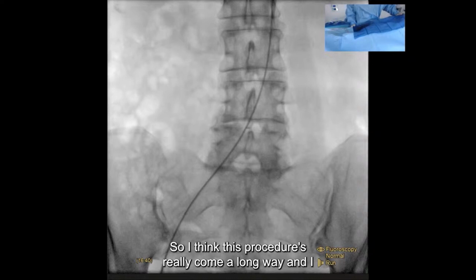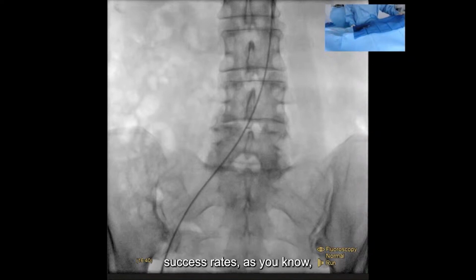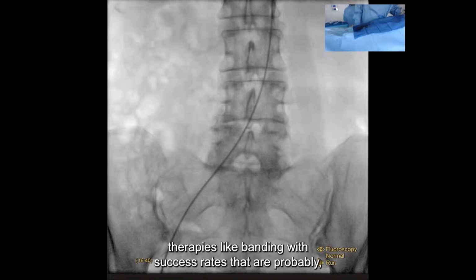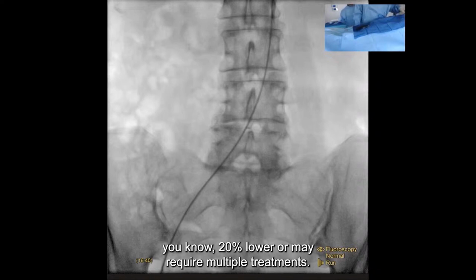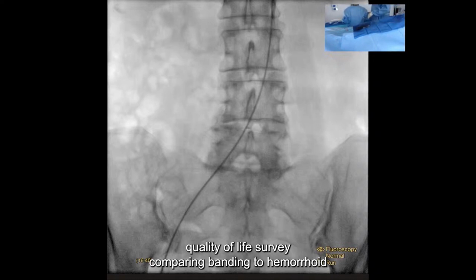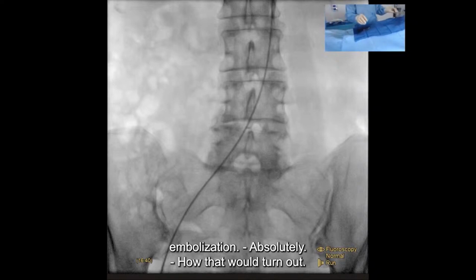I think this procedure has really come a long way, and offering it with such high success rates, published now at over 90% consistently, compared with other therapies like banding, with success rates that are probably 20% lower or may require multiple treatments. It has become very desirable for our patients. It'd be interesting if there was a study that did a quality of life survey comparing banding to hemorrhoid embolization. Absolutely. How that would turn out.